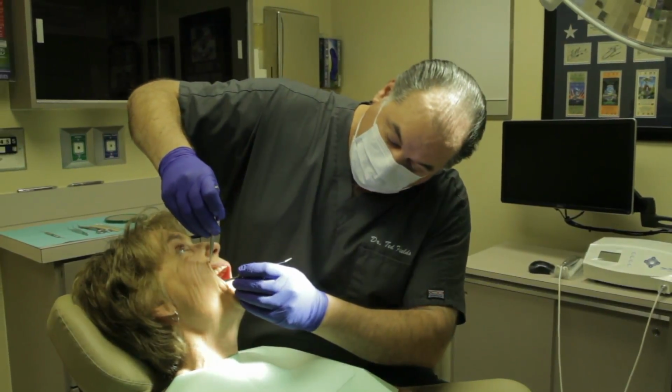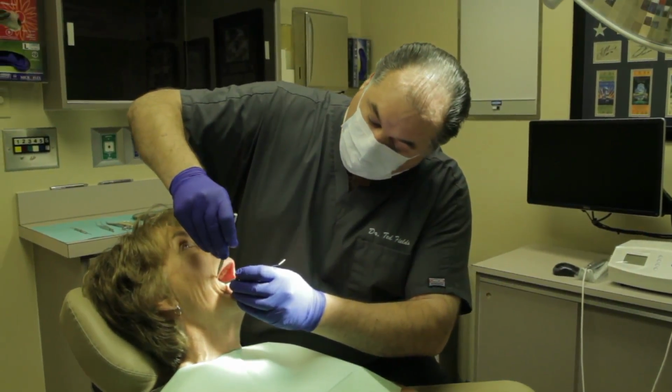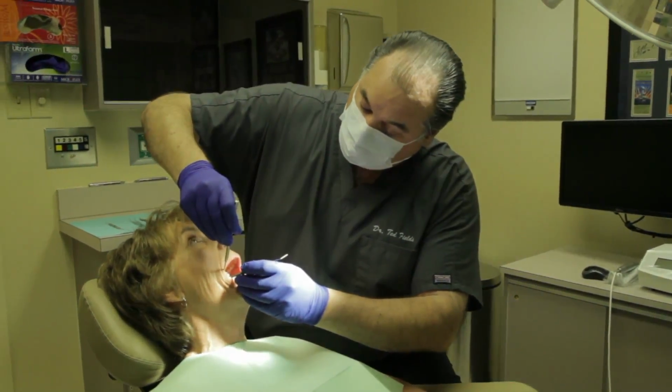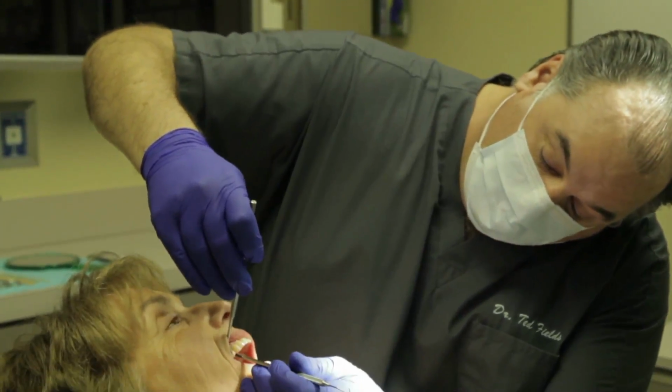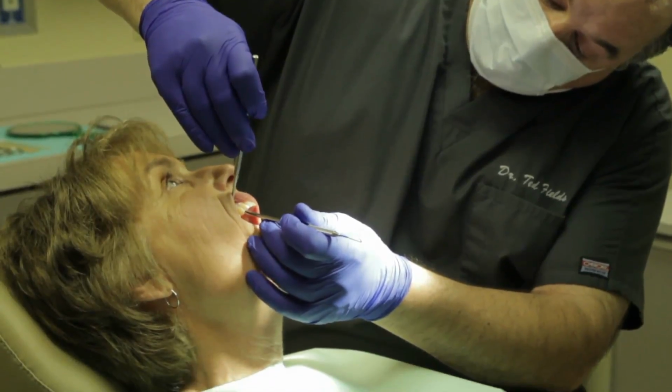Literature and clinicians report that they see less plaque and healthier soft tissue around zirconia implants. This is most likely related to the low surface free energy of this material. Another effect is the hydrophilicity or wettability of this surface.